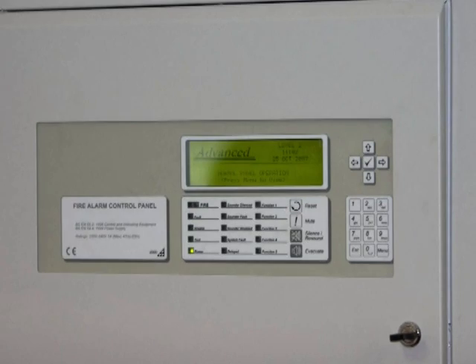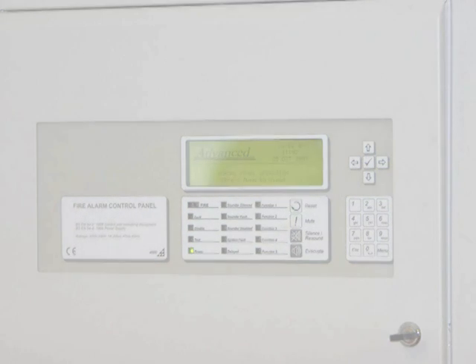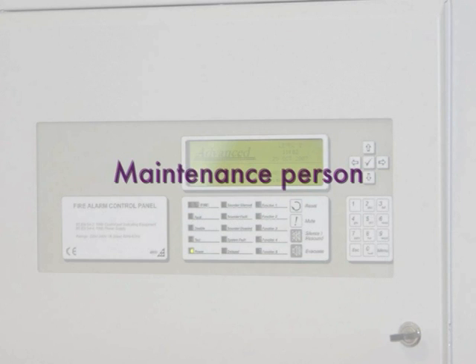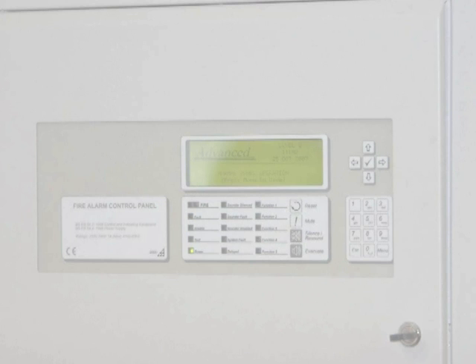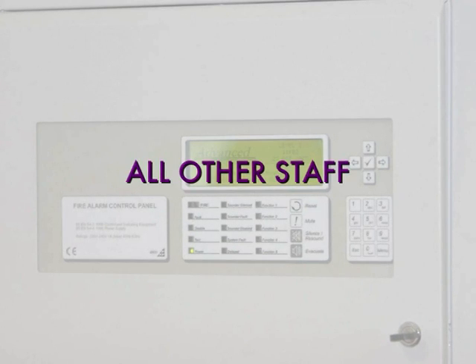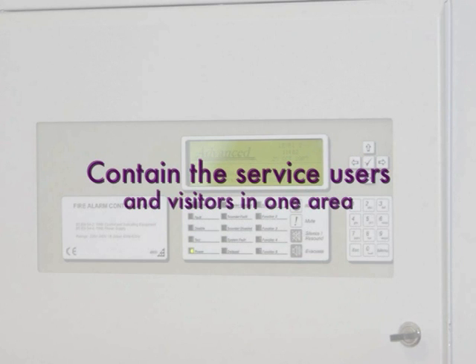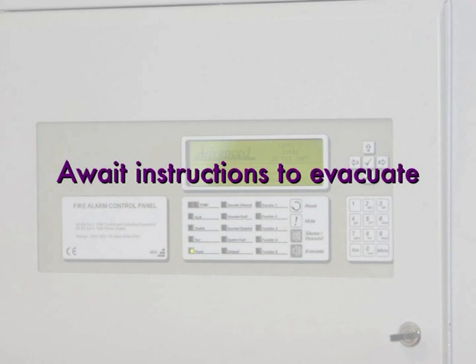On activation of the fire alarm, one nominated member of staff from each floor or unit should go to the main fire panel. Catering staff, laundry staff, domestic staff, maintenance person, administrator and activities organiser should also meet at the main fire panel, along with the home manager, responsible person, and/or the competent person. All other staff should ensure that all the fire doors have closed, reassure the service users, if possible contain the service users and visitors in one area, and await instructions from the competent person to evacuate.